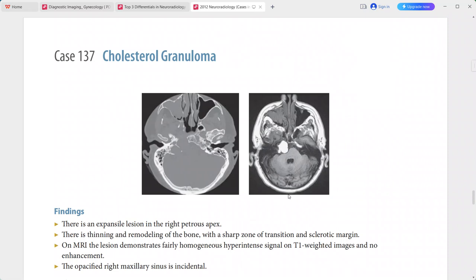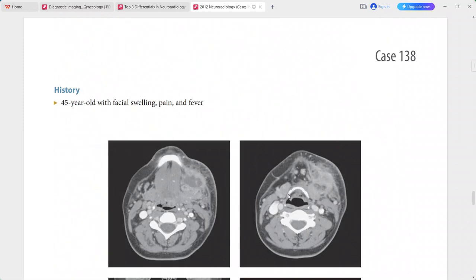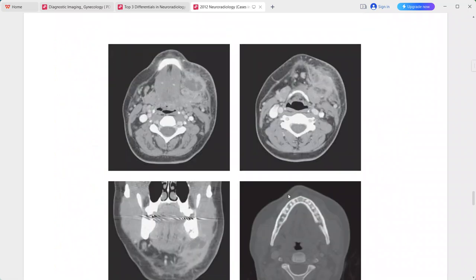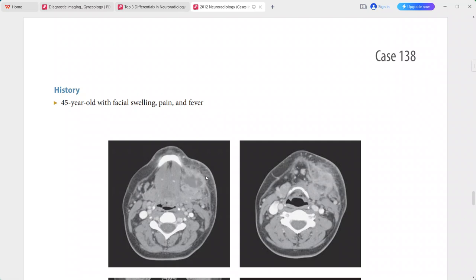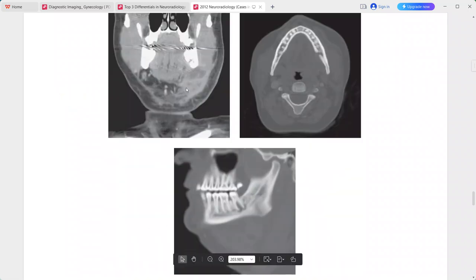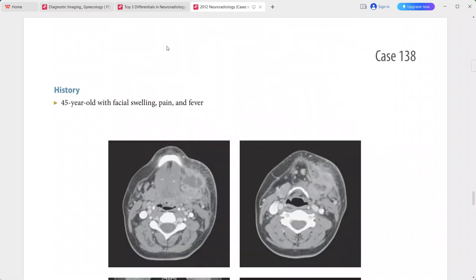A 45-year-old presenting with facial swelling, pain, and fever. There is a well-defined rim-enhancing low-attenuation collection in the left submandibular space with secondary inflammatory changes including fat stranding in the adjacent fat, and thickening of the platysma muscle.